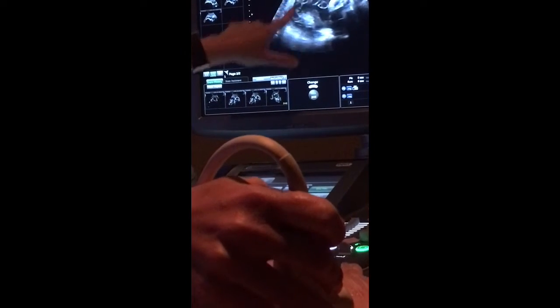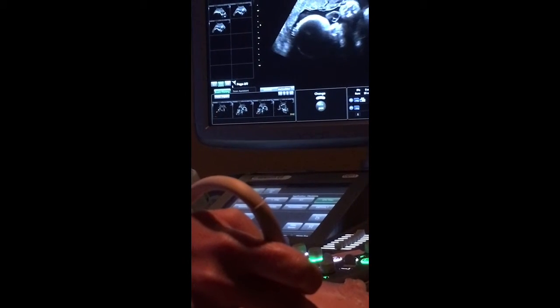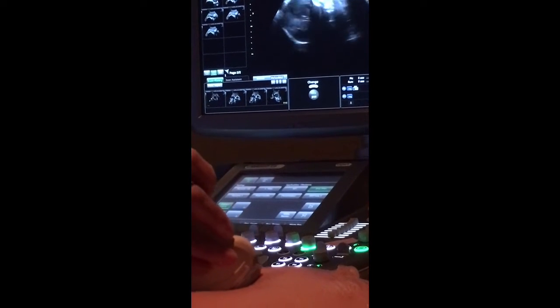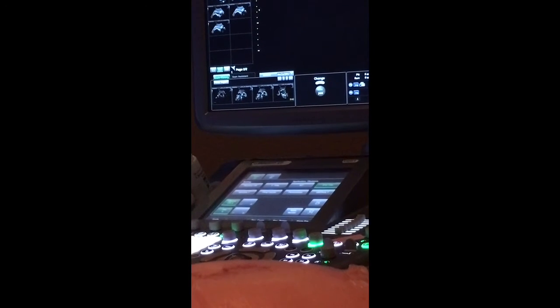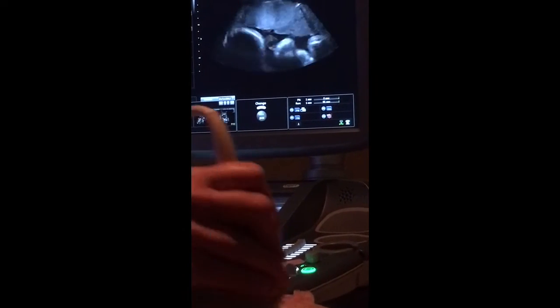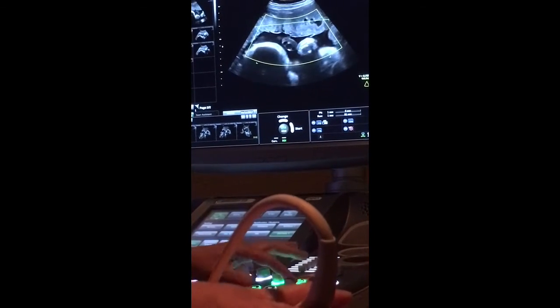She's got a big piece of cord coming right up in front of her. I'm gonna try to show her to y'all, but that may be in the way of her face. It won't hurt her. It's not in a bad place. It's just a loop that goes up and comes back down. I'm gonna try to show her to y'all in 3D, and it'll be in the way. I can tell by looking at it. It's probably gonna block her view, but maybe we can see some of her. She's got those legs and arms all up there too.